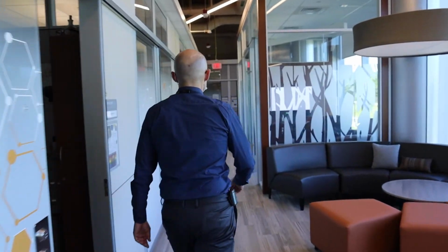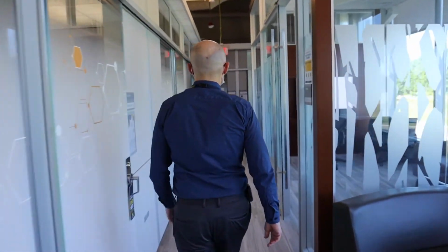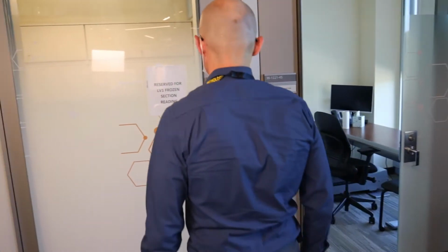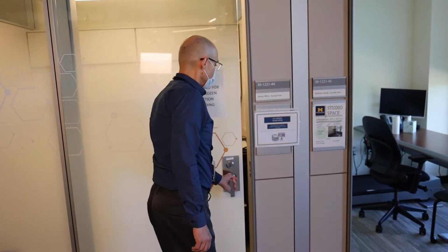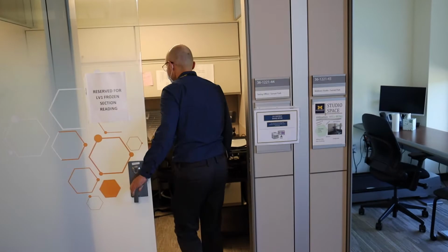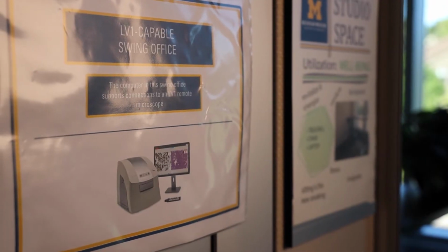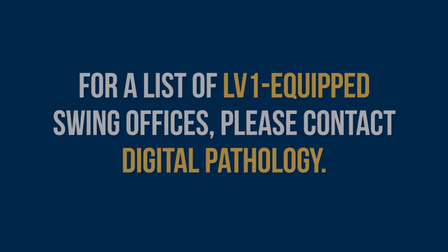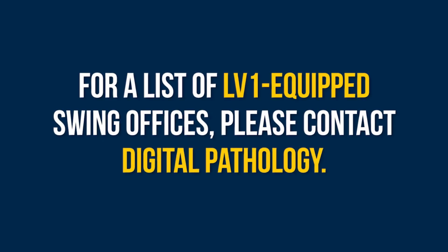For backup access, and for faculty that may only occasionally need to use LV1, select swing offices have been equipped with computers that meet telepathology specifications. These are indicated by signs posted outside the door. For a list of swing offices equipped, please contact Digital Pathology.